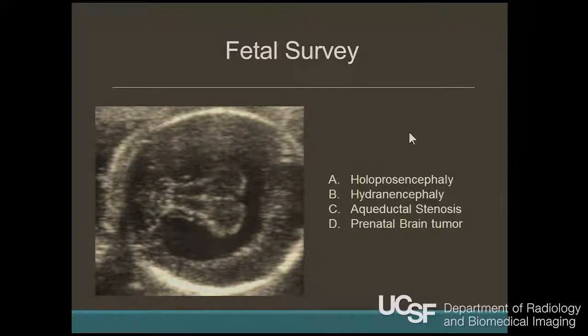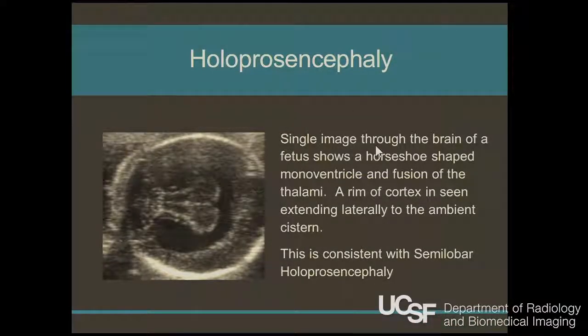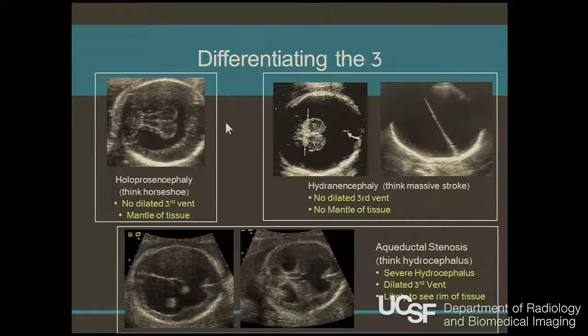This you probably won't see, but I just want to show it because you see it on board exams sometimes. And this is holoprosencephaly. The reason I show it again is because when I was studying, I always got confused with holoprosencephaly or hydranencephaly or hydrocephalus. And again, they don't look exactly the same, so you can make the distinction.